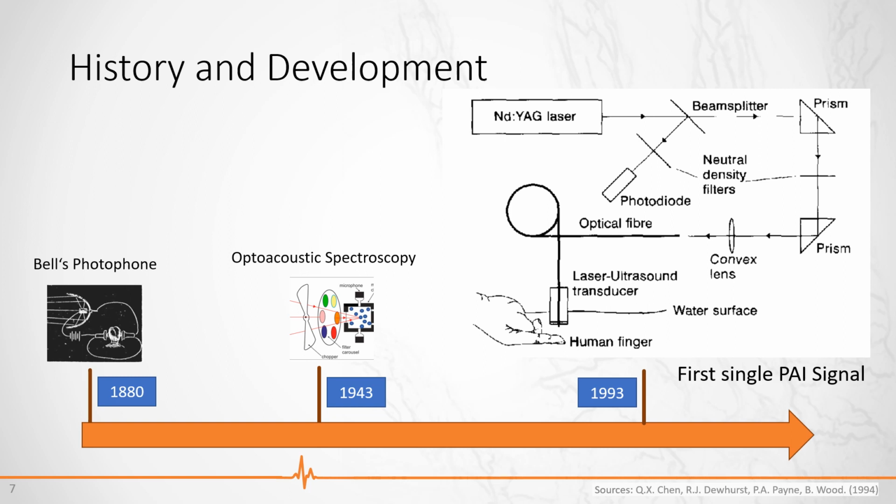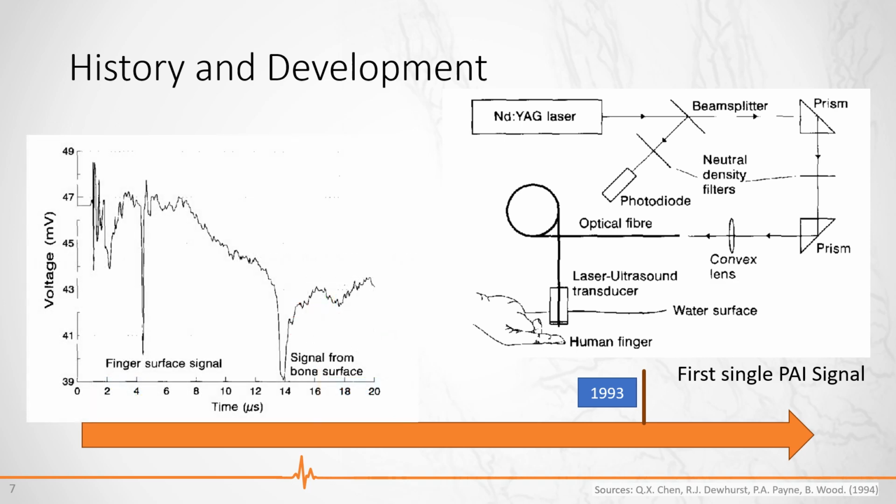In the experimental setup, you can see that the laser pulse is transmitted via an optical fiber, and the ultrasound signal is measured by a concentric piezoelectric polymer transducer surrounding the optical cable. In the detected signal, one can see the high potential for good depth resolution of this technology.